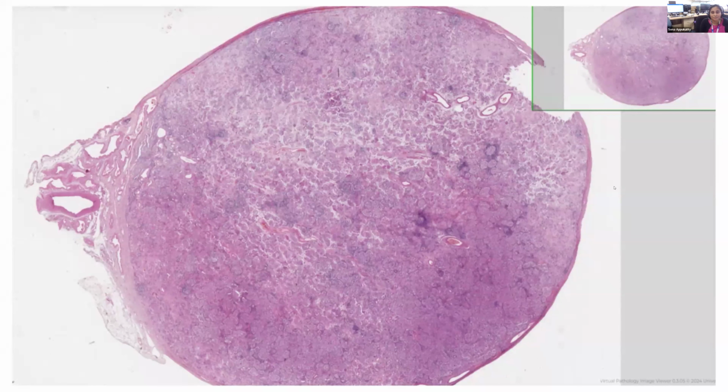So we have a testis view with some rete testis here. Some looser tissue here, probably atrophic changes, and the lower bottom looks mostly granular with some pink nodules and some blue cells, probably some lymphocytes. Go a bit higher power.